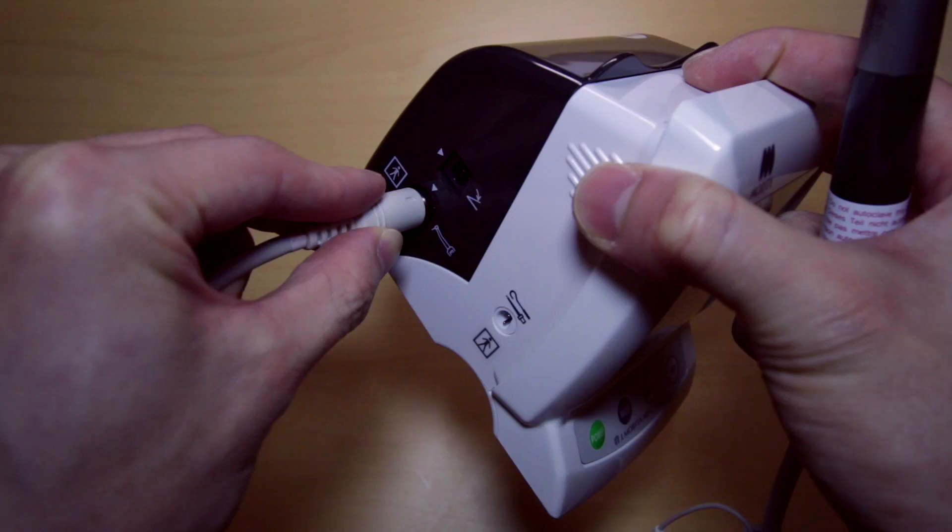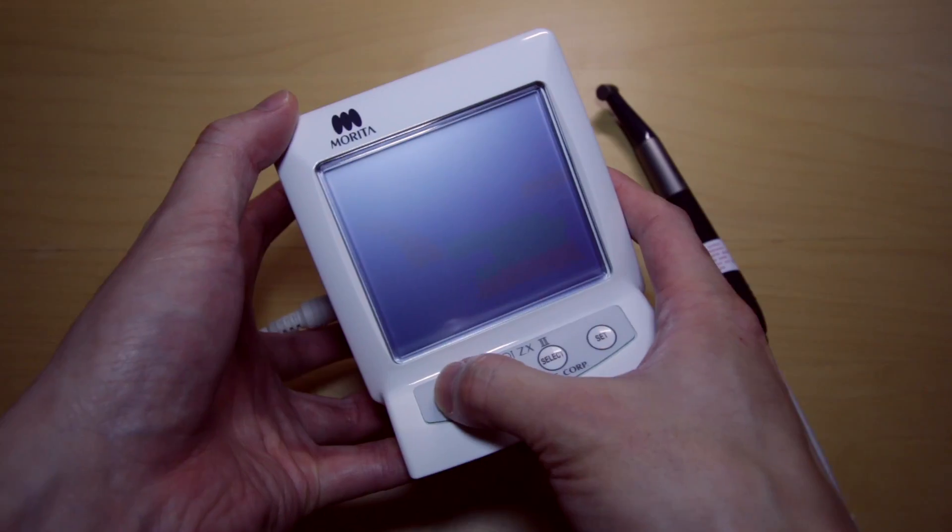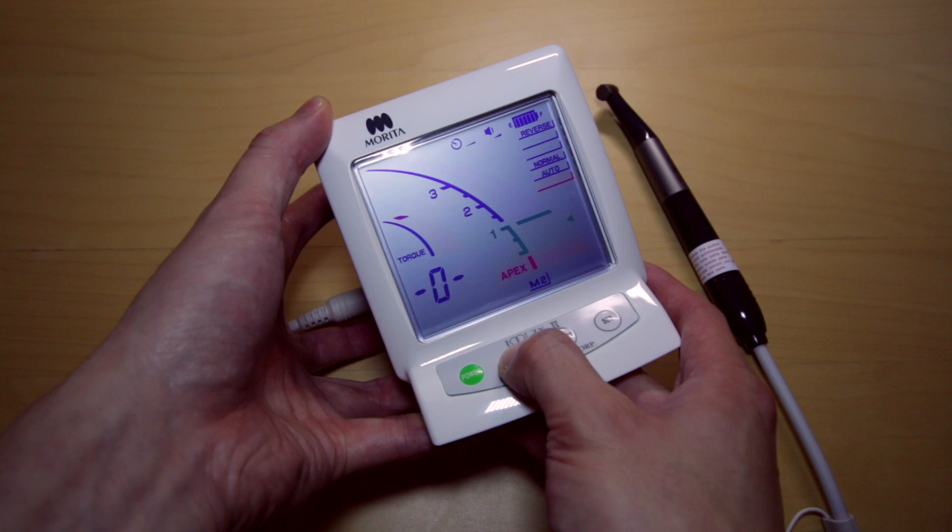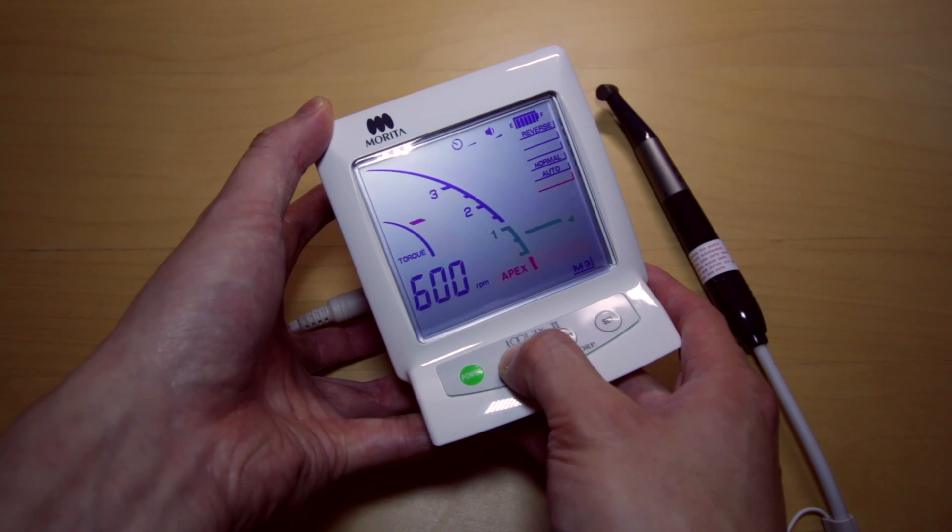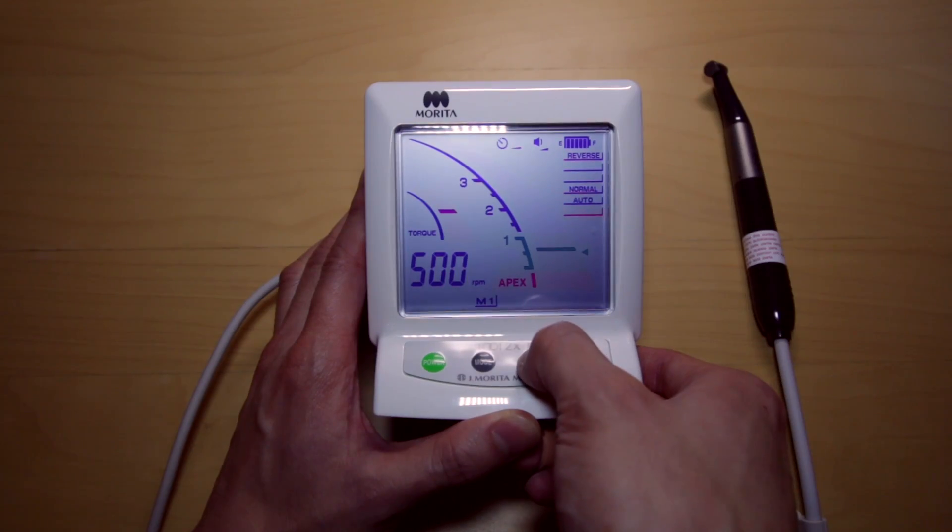Let's install the handpiece first to the side of the module. This automatically engages functions of the rotary. You can then set your ideal torque level, apex location, and RPMs.